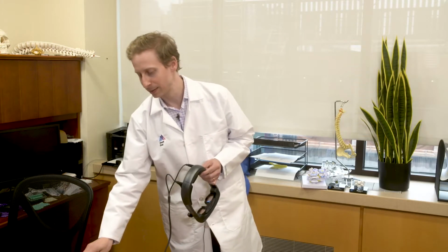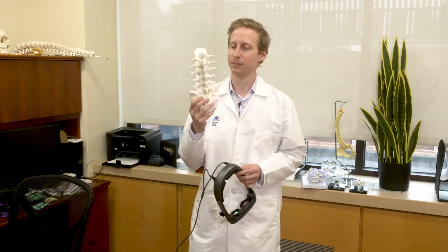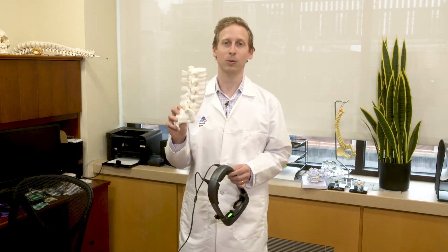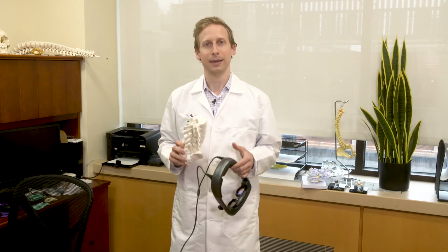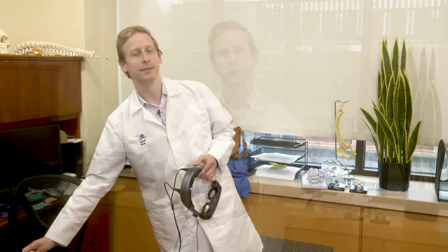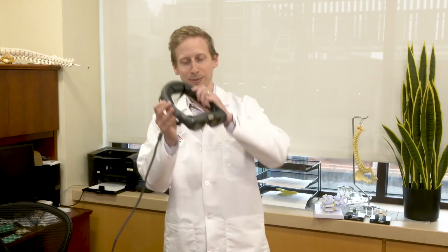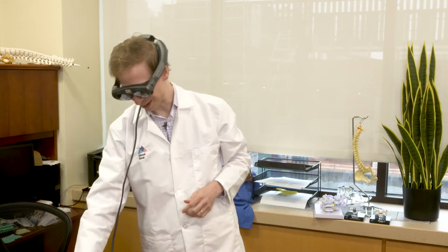So patients come into your office, they're often very overwhelmed by what you're telling them. You can use a spine model, you can show them their pathology on a model, but it's never the same as having their own MRI, their own CAT scan fused together in a virtual model for them to really look at everything and understand. So without further ado, this is how we put on the augmented reality goggles.